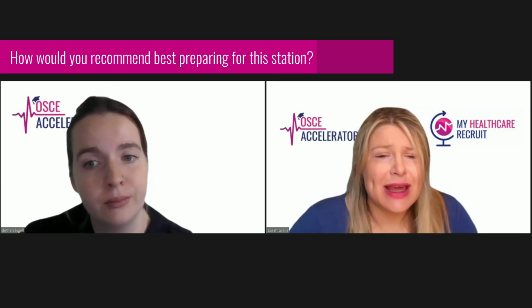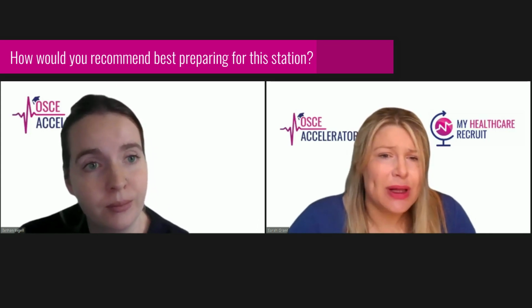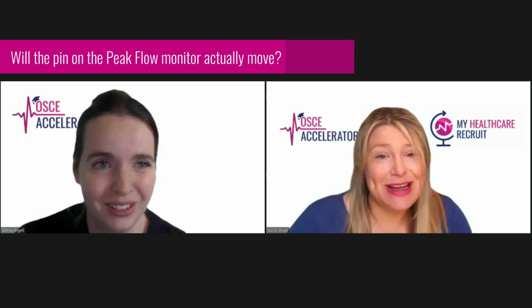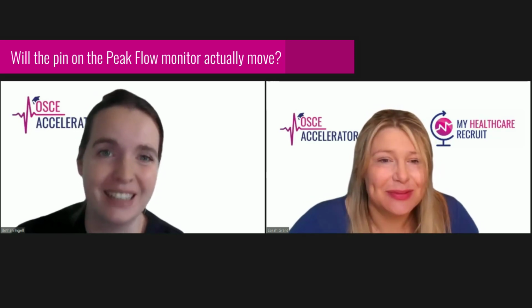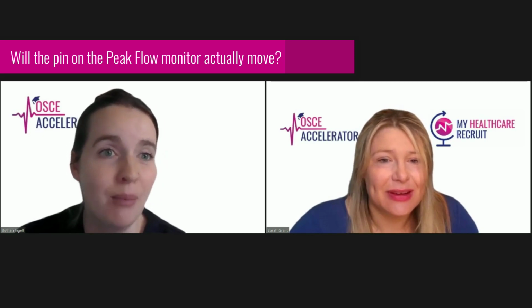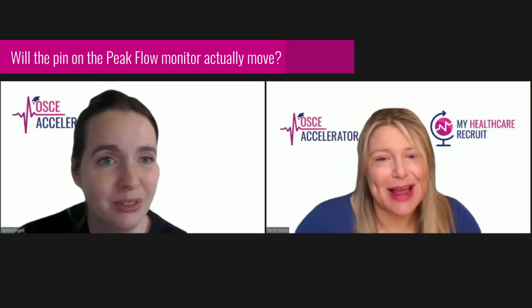Wonderful. And at this station, it's a mannequin, so will the pin actually move, or will it just be the examiner telling you that the reading is such and such? Yes, I forgot to mention that, so you're right. The examiner is either going to move the needle for you or tell you the reading. But in practice, the dial would move. That makes sense. Of course.